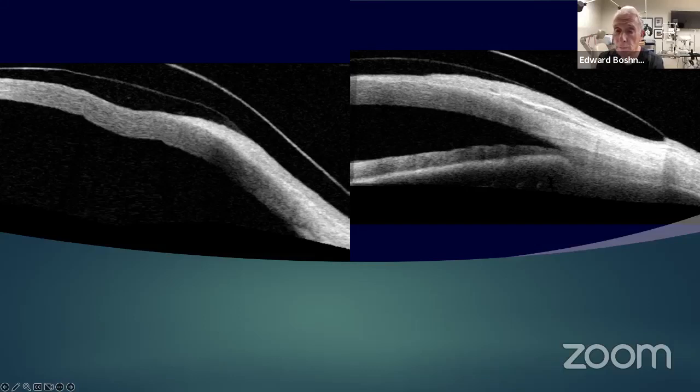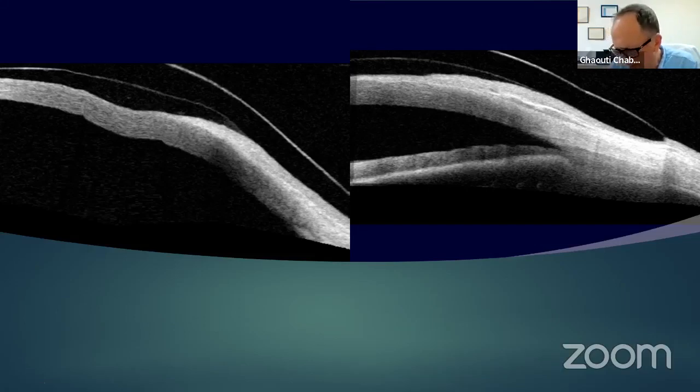Great question. Any advice for young fitters? Do you think that investing in new technologies such as OCT, SMAP, and iPrint, and I think profilometry like the Eaglet, which is available in Europe and maybe other parts of the world, are something you should really consider. It'll make your life a lot easier and get a more accurate fit.